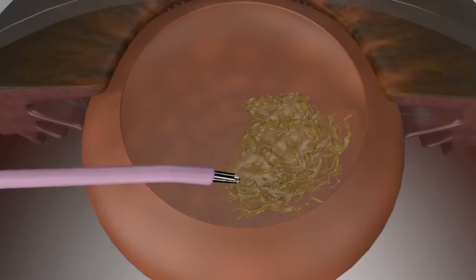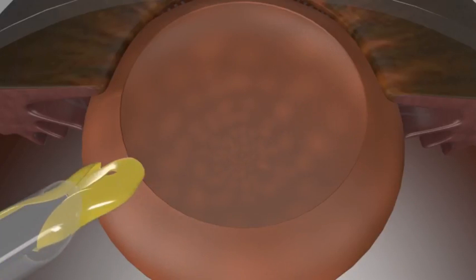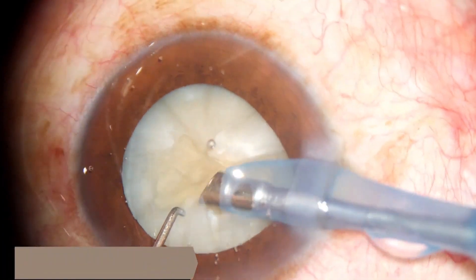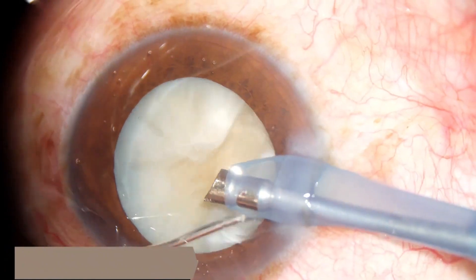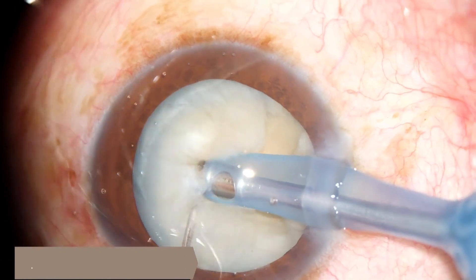The idea is like this, so that fellows and young surgeons don't have such depth perception during the chopping, so they are safe. That's how you do it in a real life scenario. For experienced surgeons also, I think I'm using this for many of my hard cataracts.